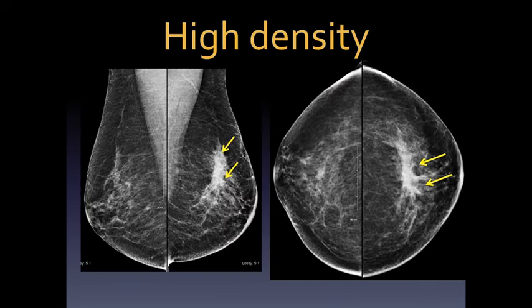Now let's look at distribution, subdivided into diffuse, regional, grouped, linear, and segmental. Diffuse is a random distribution throughout the breasts — you can see this with multiple round punctate calcifications diffusely seen throughout both breasts. This is very uncommonly associated with malignancy.